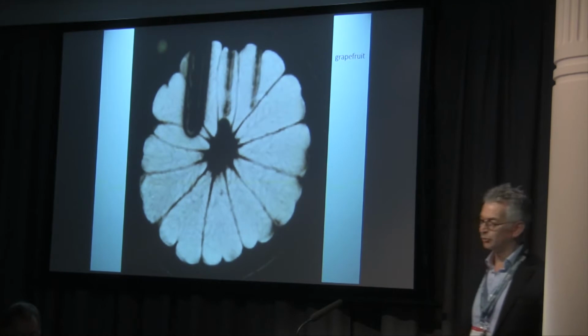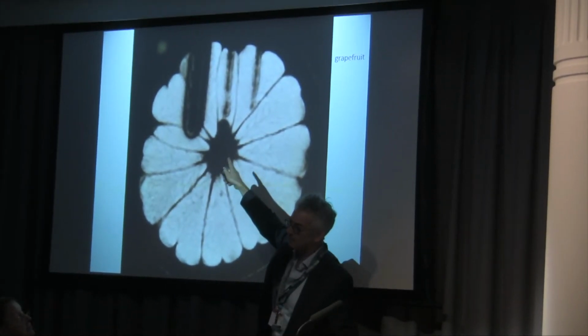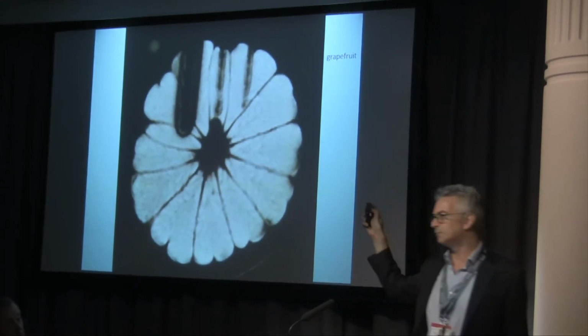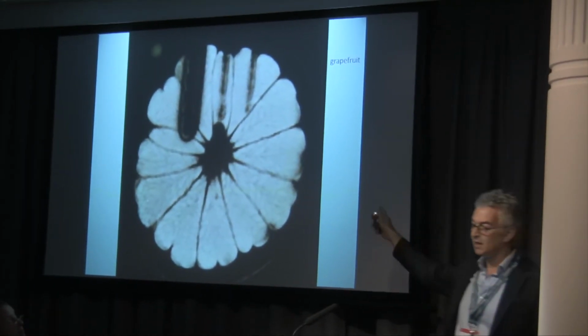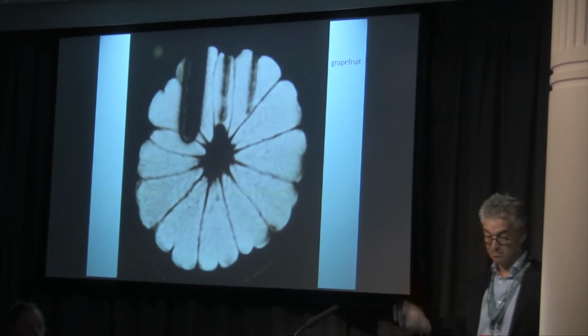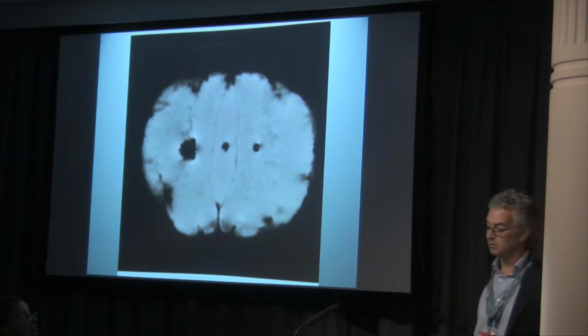This is what it looks like in a grapefruit. This is the metallic MR compatible needle, which is mostly nitinol and titanium, but there's a little bit of iron in it, and you can see it's like shoving a cigar in. How accurate is that? And these two other needles were little carbon fibre needles, which are fairly representative of the size of them. They're a cross section.